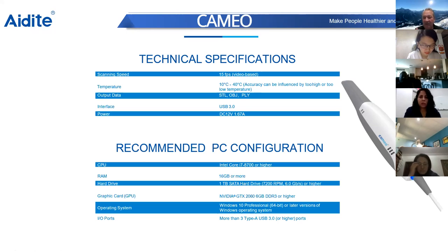And the nice thing is that we don't need to buy a closed system, meaning a machine which has a screen and a PC in it, because you can't really update those, or only for lots of money. Here you buy something yourself, like a desktop, where you can put in a card and change the graphic card, you can change things in it yourself and make it faster and faster when things get faster.